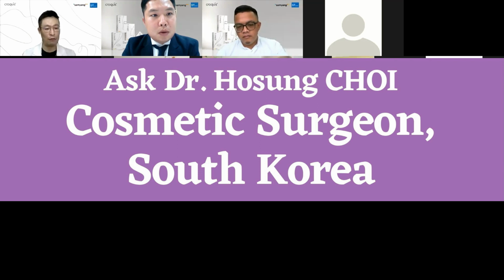But removing the thread after 1 month of the treatment is very difficult because there is already adhesion between the thread and soft tissue, so it's not easy to remove cleanly. So if you want to remove, just remove within 1 month after treatment. But if 2 or 3 months have already passed, then it's better to wait and see.